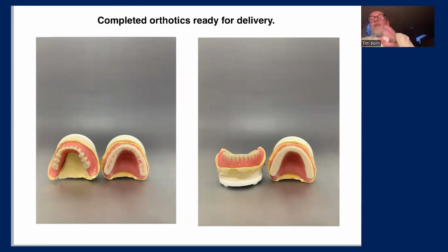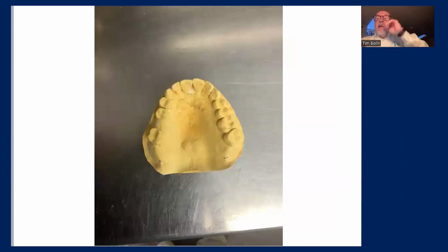Now, this is one of the things that we see a lot in the laboratory. We receive a lot of bite splints and night guards, and I will get just 2 models from a doctor with a note, please make appliance. Now that's all fine and dandy, but I don't know where I'm supposed to be or how far we're supposed to make this.